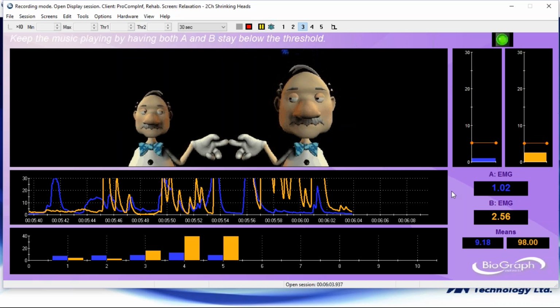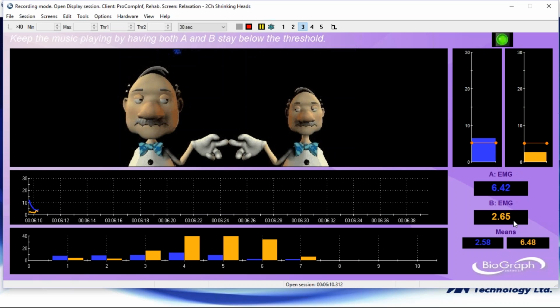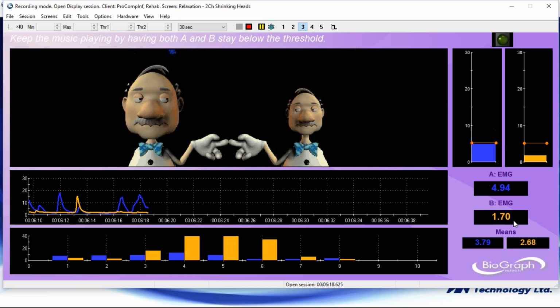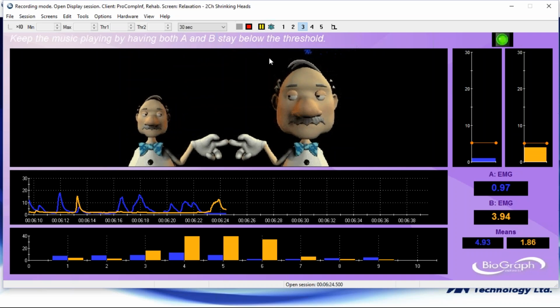One thing that we get quite often in EMG is these numbers are very difficult to follow. We can dampen those and slow those down so they're a little easier to track in real time. It's not going to disrupt the raw data we're collecting. One thing we've done well over time is protect our raw data, so you're always going to be able to go back and take a peek at really what's going on.